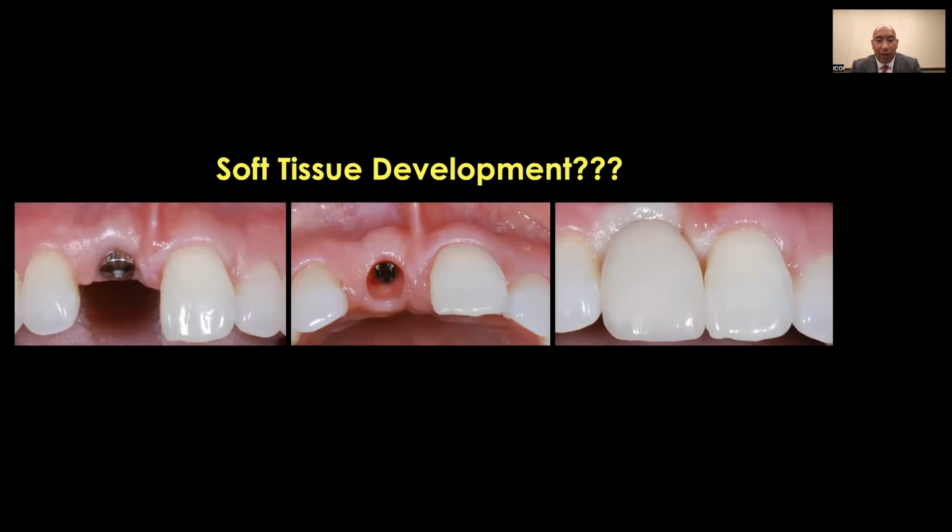The problem with that approach was that a lot of my dentists would just go straight from this narrow healing abutment to taking a final impression, and of course the crown would come back kind of big, and they would just numb the patient up and squash the crown on. And that would be how it worked. If the tissue responded positively, we had a great result. If it responded negatively, then we had a result like you see here, and patients weren't always happy.